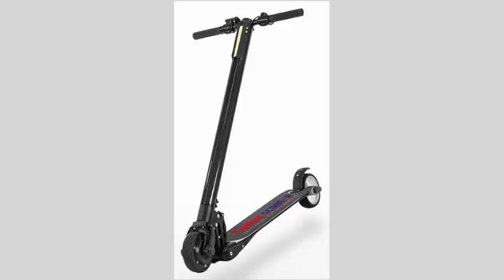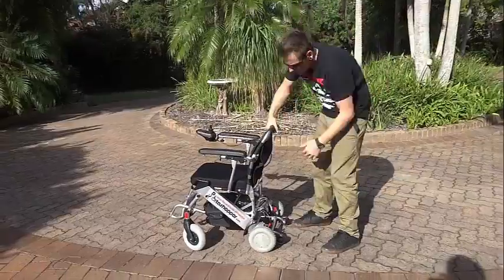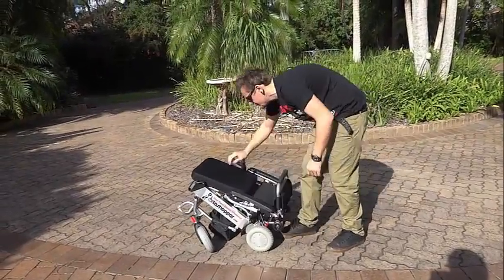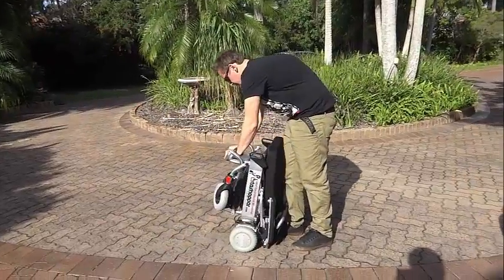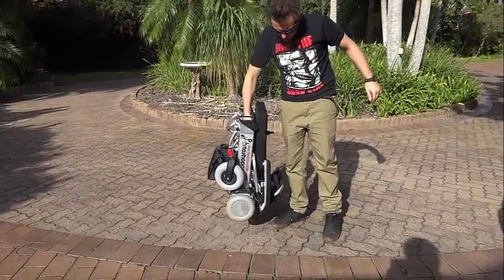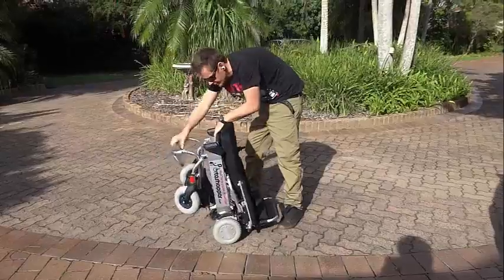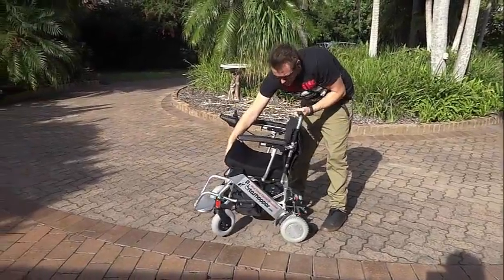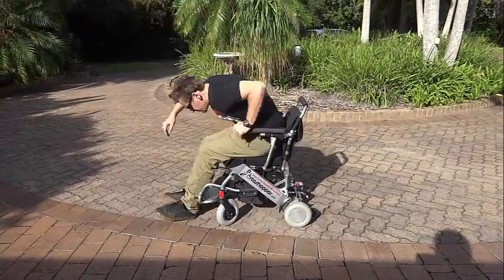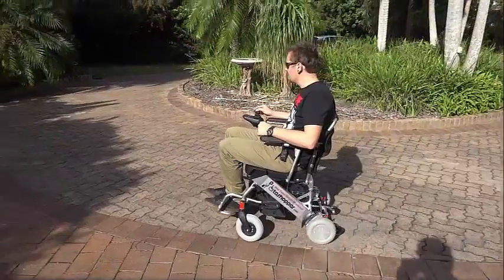Allow me to run through our range very briefly while highlighting the prominent features of each. To start off with, we have the Portashopper 2, which is still our lightest electric wheelchair at approximately 22kg or 48lbs all up with battery included and with the smallest footprint of all. Even though it can carry people weighing up to 120kg or 264lbs, it is ideally designed for children and small to medium adults weighing up to 100kg or 220lbs.